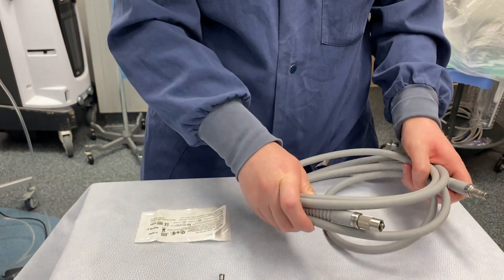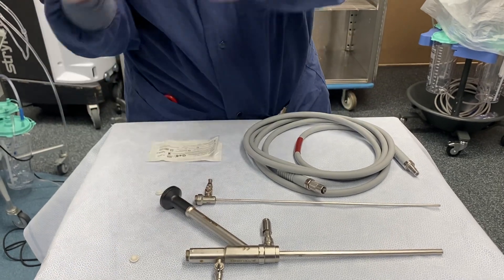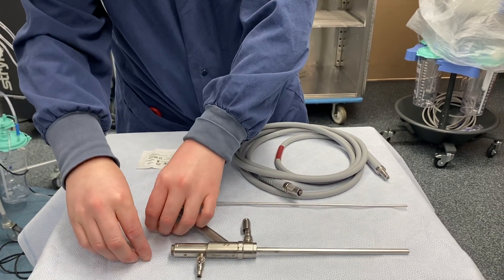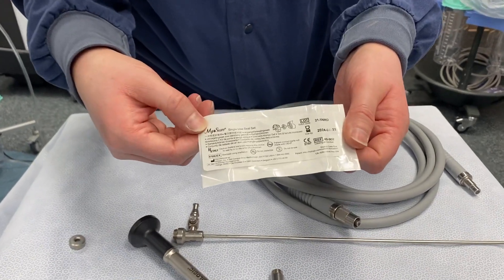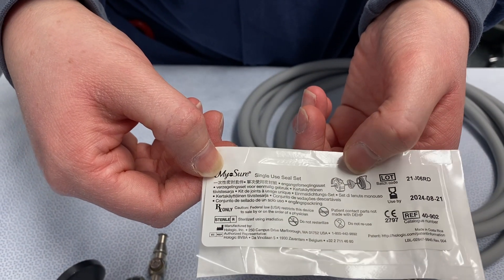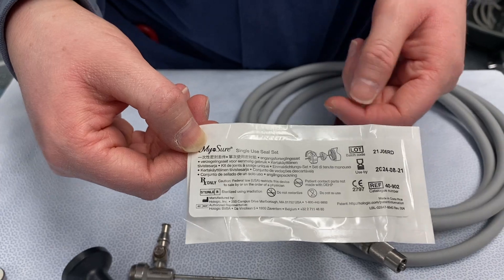Then you have your light cord, your light post that goes to your scope, and then you have two metal caps and two white gaskets that come separately in a MyAshore single-use seal set. You can see on here it shows you how to put them in. The bubble part of the seal points distally towards the end of the scope and then the metal cap covers that.